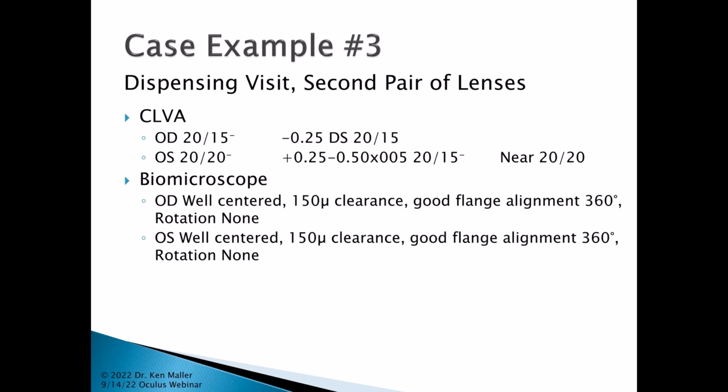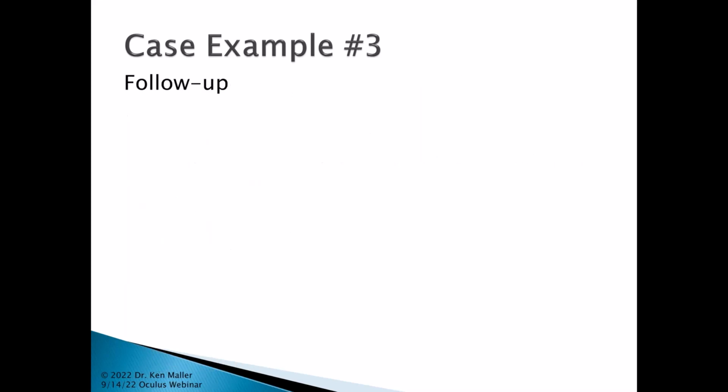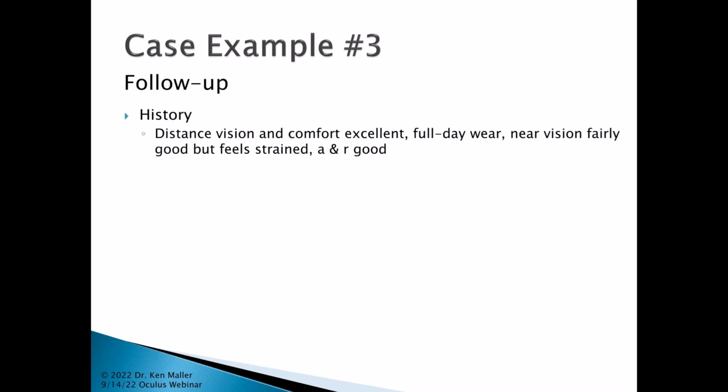Well centered on both, 150 microns of clearance on both. The flange alignment was very, very good, and there's no rotation on either lens. I dispensed the lenses, brought it back for follow-up. Distance vision and comfort, excellent. She's wearing them full day.